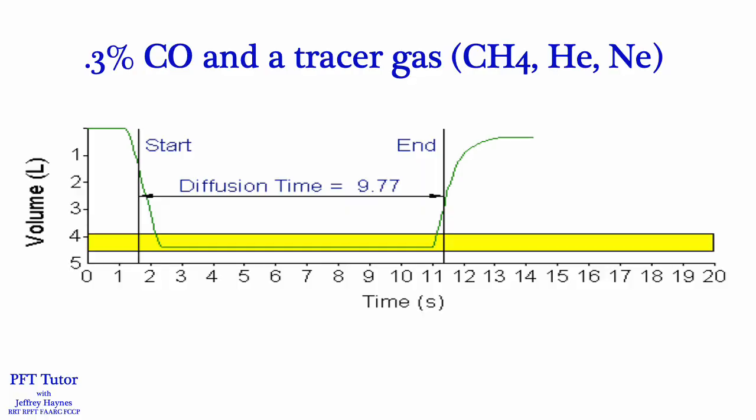The patient is instructed to exhale fully or as close to residual volume as possible. Once the patient has achieved this, they are switched into the system and they are instructed to rapidly inhale the DLCO test gas to inflate the lungs as closely to total lung capacity as possible. The inspired volume should be at least 90% of the patient's best vital capacity, and the patient should achieve 85% of the inspired volume in less than 4 seconds.